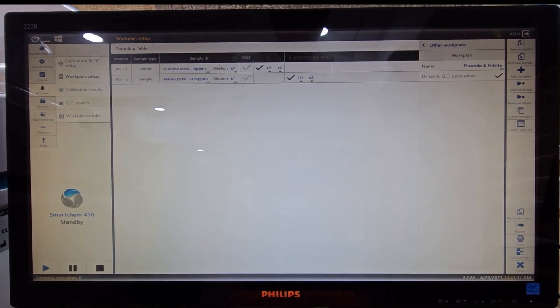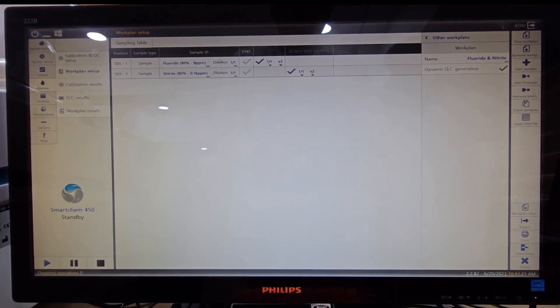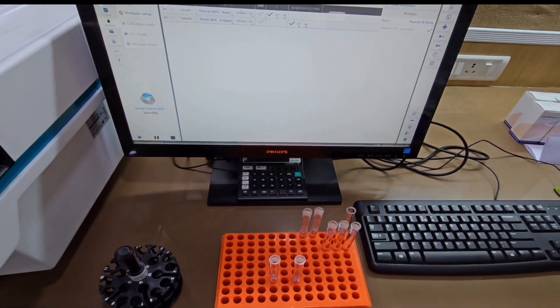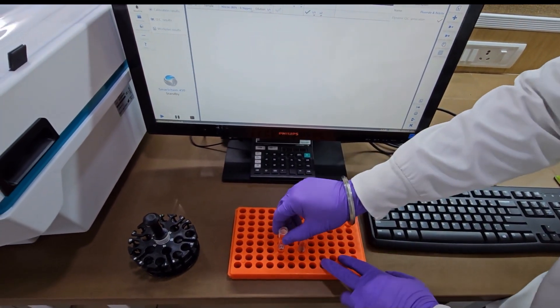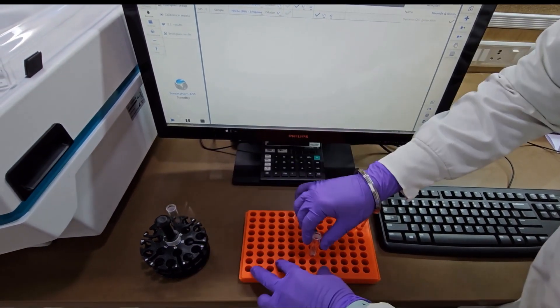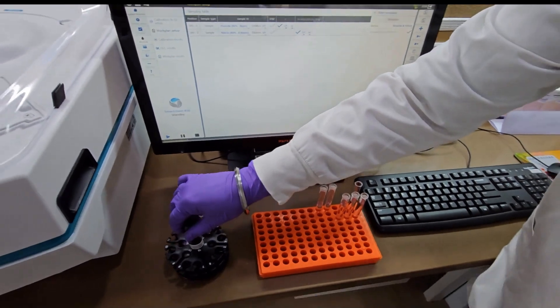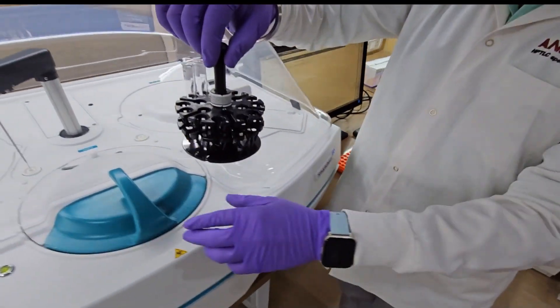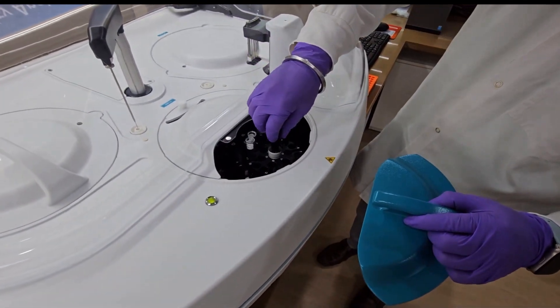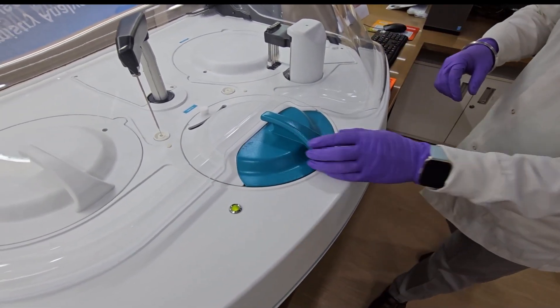I have created a work list for our sample analysis on the software. As we kept our reagents, we will now be keeping our samples. Just 5 ml of sample is required for analysis of both parameters. Just loading the sample tubes and keeping the rack inside, we are done. We are using this amount of sample for two parameters, but more parameters can be done from the same amount of sample.